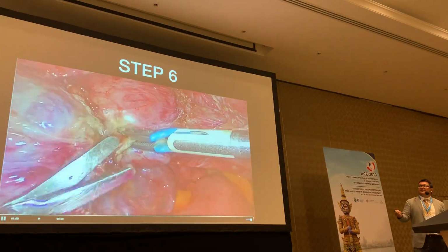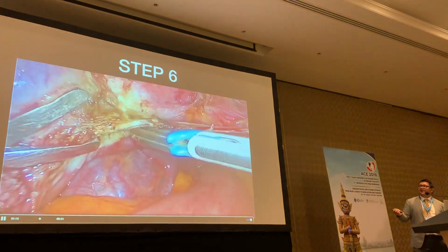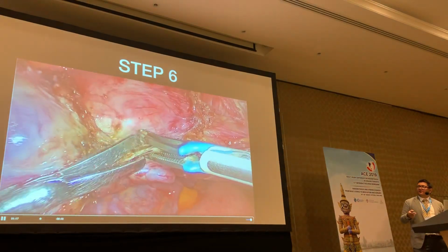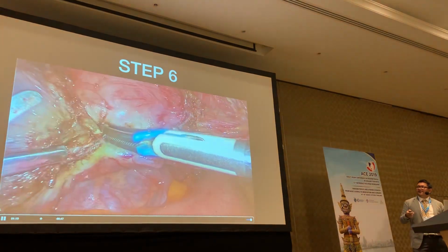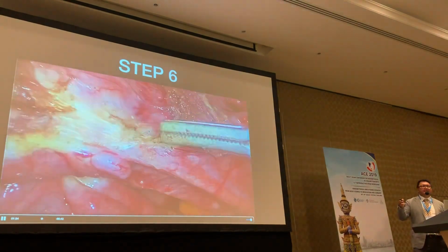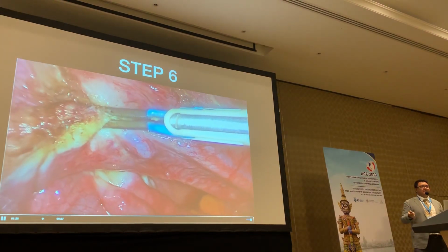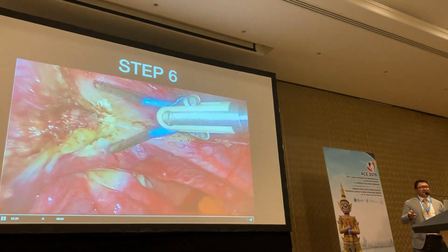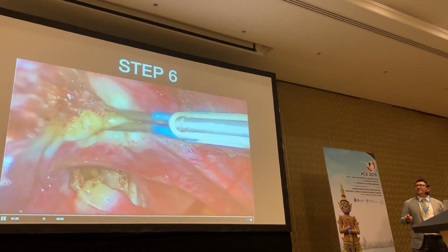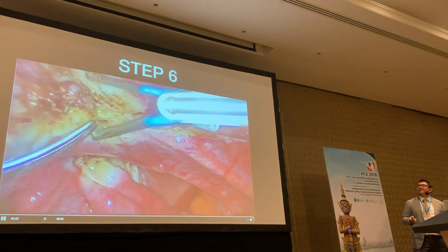Here, this is very interesting to show because this is where I make a mistake. In the effort to save time, you cut across the area that's coagulated. So you're going to cause a little bit of retraction. I thought this was important to show why you should optimally approach perpendicular and not take shortcuts. I always say laparoscopy is a very cruel mistress. If you make one mistake, you have to do 10 things to correct that mistake. But luckily I got away with it here because we caught it in time, so there's not much bleeding, as you will see in 1 second.